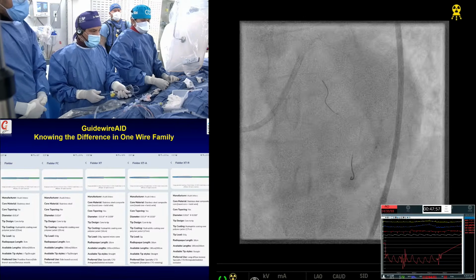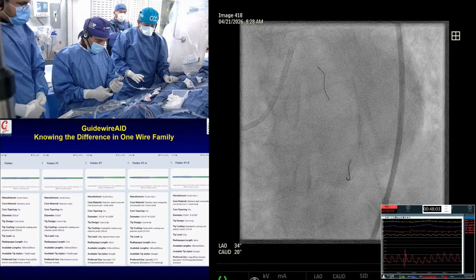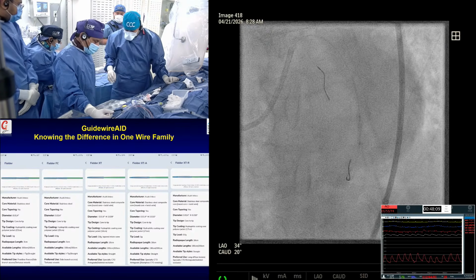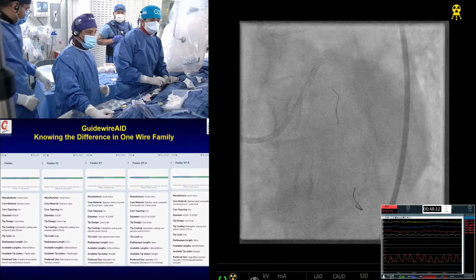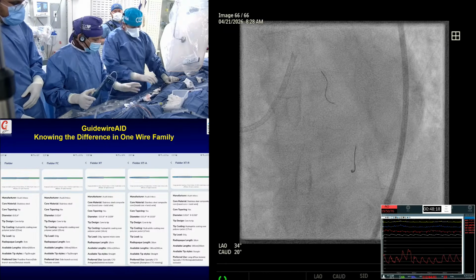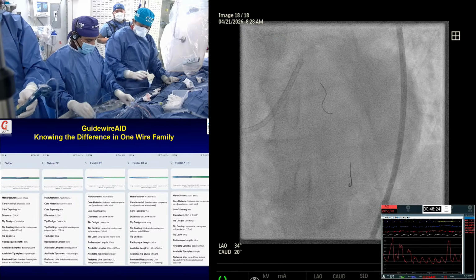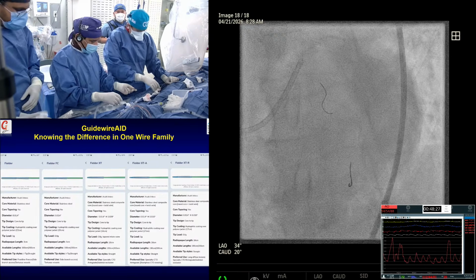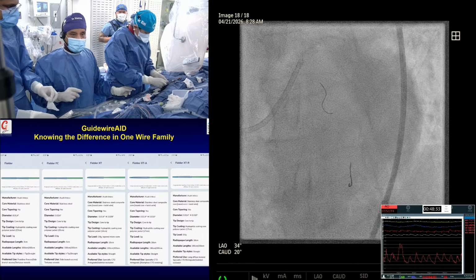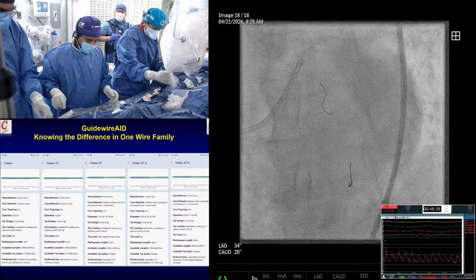Patient, actually, I can tell you, he had a non-obstructive disease many years ago. Then nowhere to be seen. And then he did a lot of Google reviews. And very clear. He said, if I want PCI done, I think he has seen some of our live cases also. Very intelligent patient. He's requesting a Zion stent. He said he wanted MiniCrush. Zion stent is like, come with everything. As long as it didn't say DCB.